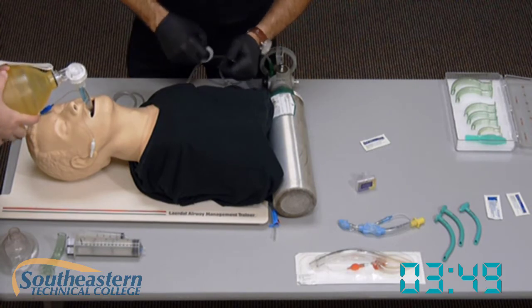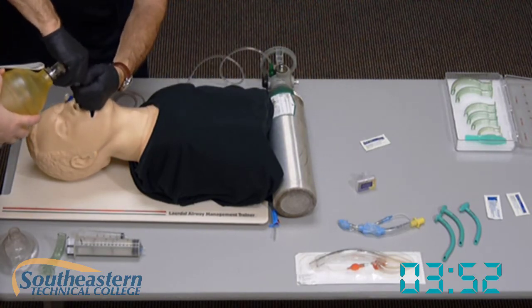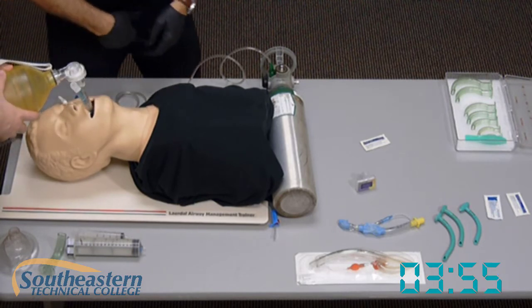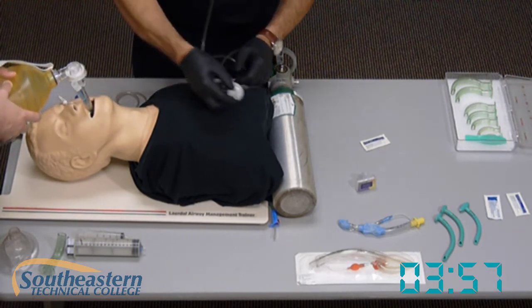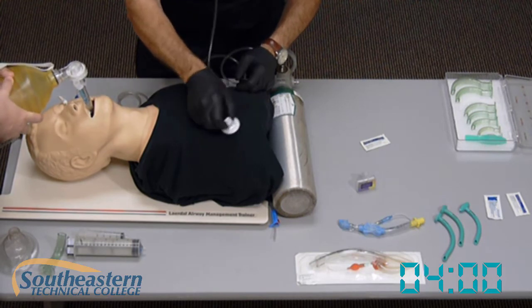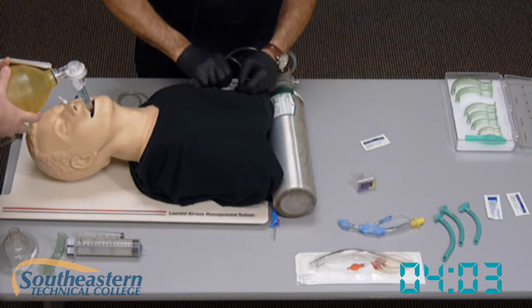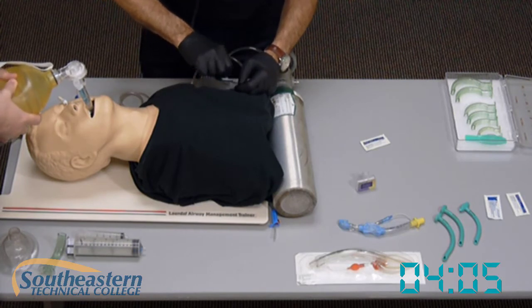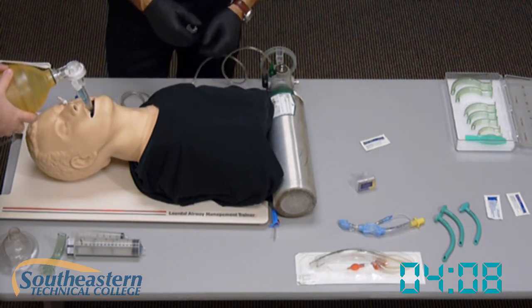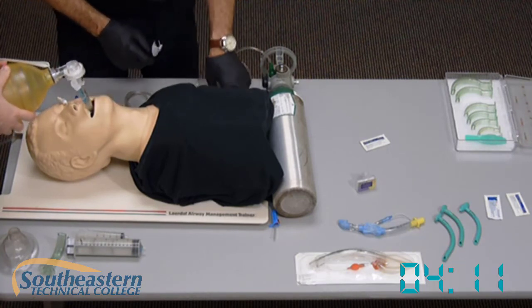Epigastric sounds are present and no lung sounds are present on the initial port, so we'll switch over to the number two port. Ask my partner to ventilate — epigastric sounds checked, right lung checked, left lung checked. I do have breath sounds bilaterally and no epigastric sounds, so I'll secure the tube.